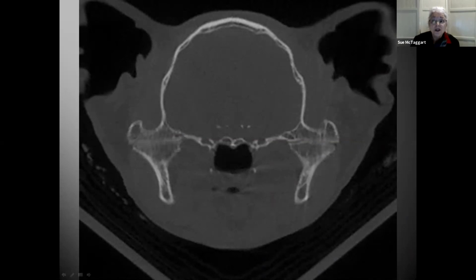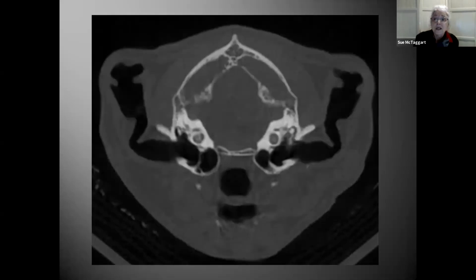The radiology report indicated no osteoarthritis, but there was narrowing of the joint space. And David Sarment can comment on how TMJ joint pain is diagnosed in the human. We were able to rule out TMJ luxation, subluxation, degenerative joint disease, sclerosis, and cysts using the cone beam. The ear canals were ruled out as a source of pain.